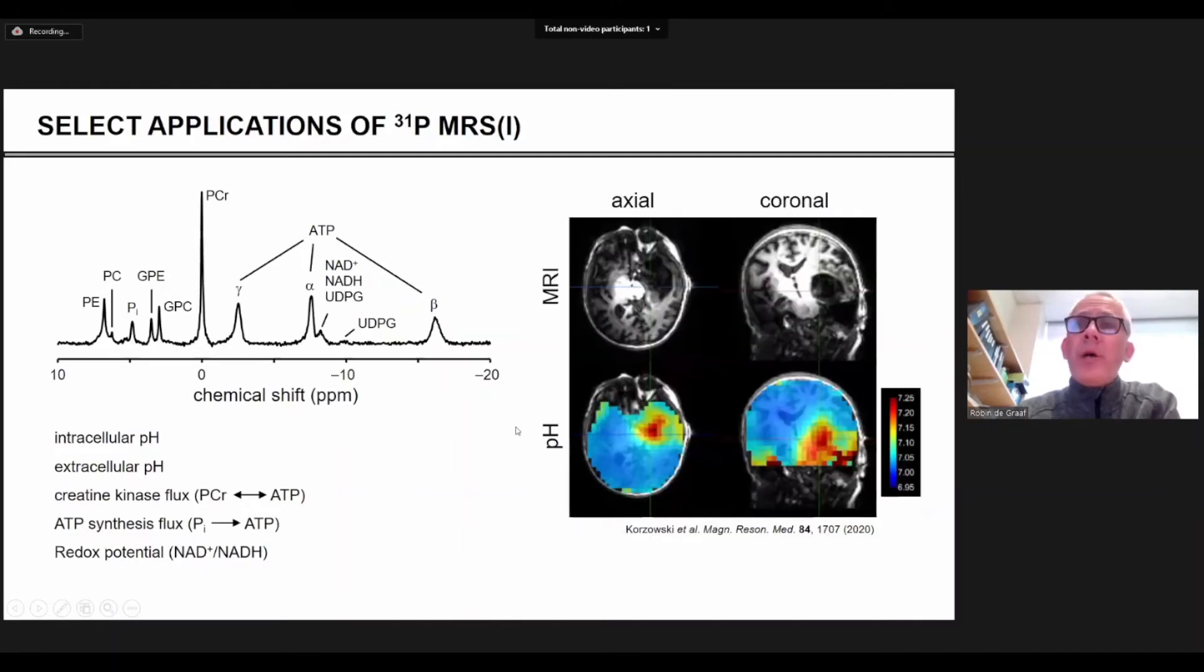Now this can also be done in 3D. This is a recent paper where they basically spatially mapped the pH. And you can see this is again in a brain tumor patient, that where the tumor is, the pH is also different.